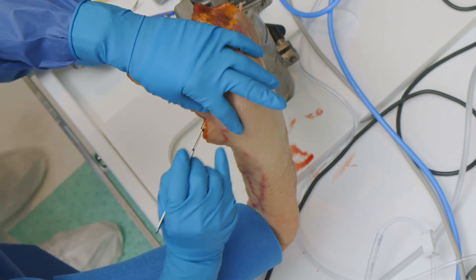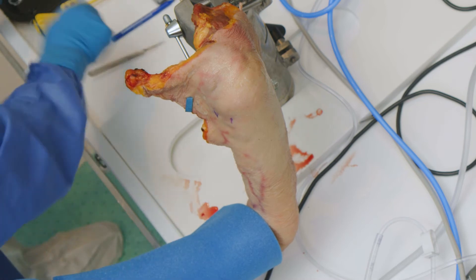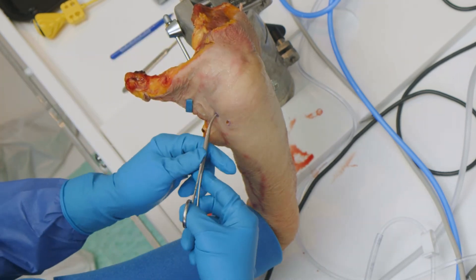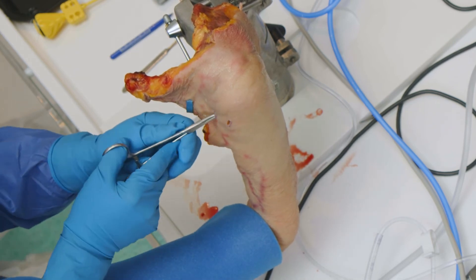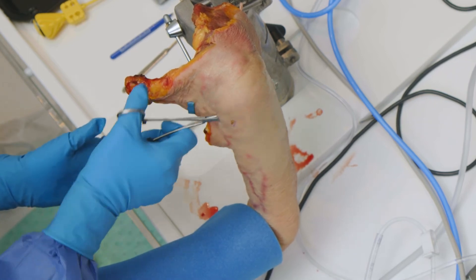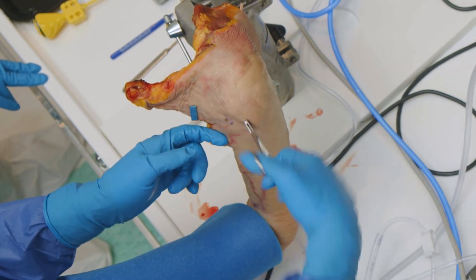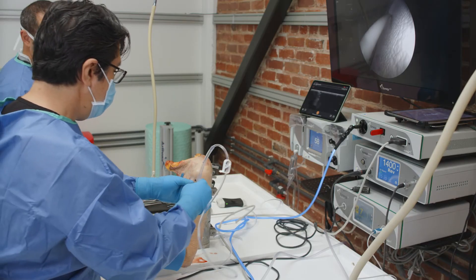We can make our incisions. We can go ahead and undermine the deltoid so we can get in and create a space in that area. Now I've created a potential space — an arthroscopic space. I just make sure I can see it really nicely and clear it out. Now we can come in with our scope and take a look.